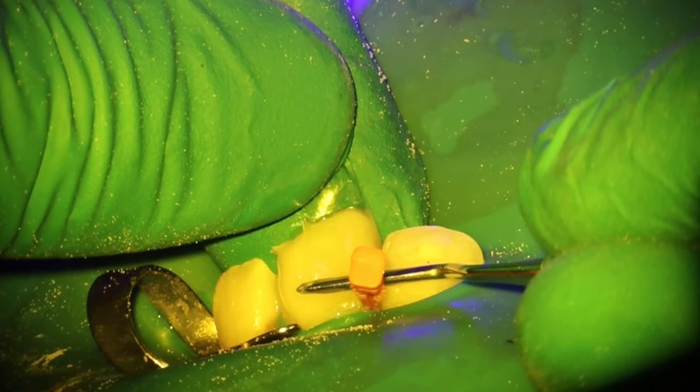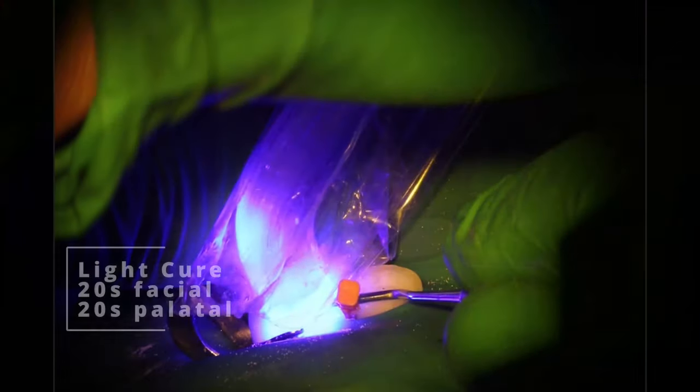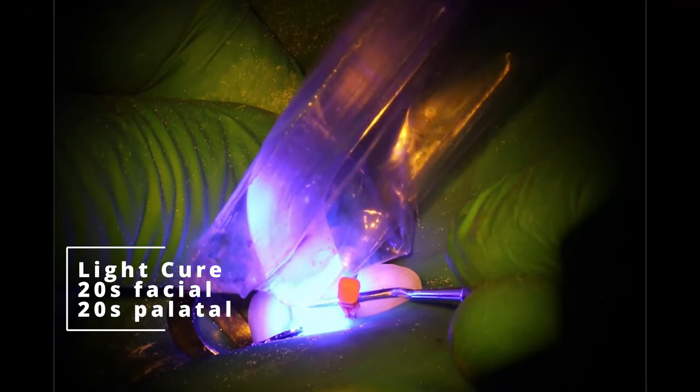Now, normally what you would do is have a matrix band on both sides, but because his tooth was so intact on the distal, I felt it was better just to have one on top of here. You want to do a couple cures on this, make sure it's rock solid.